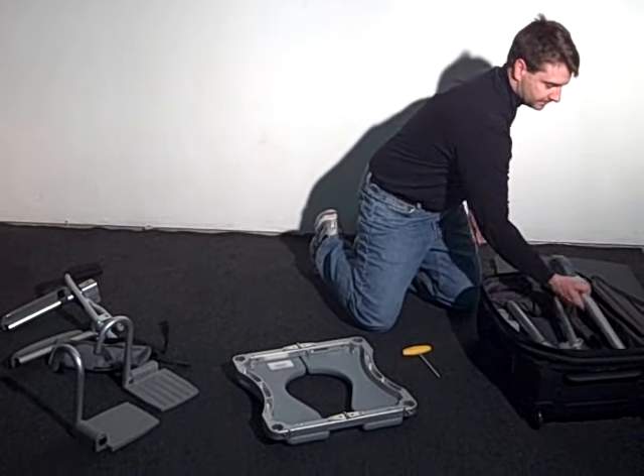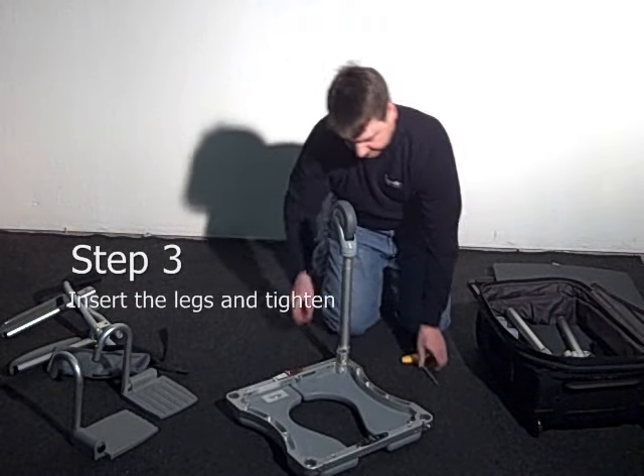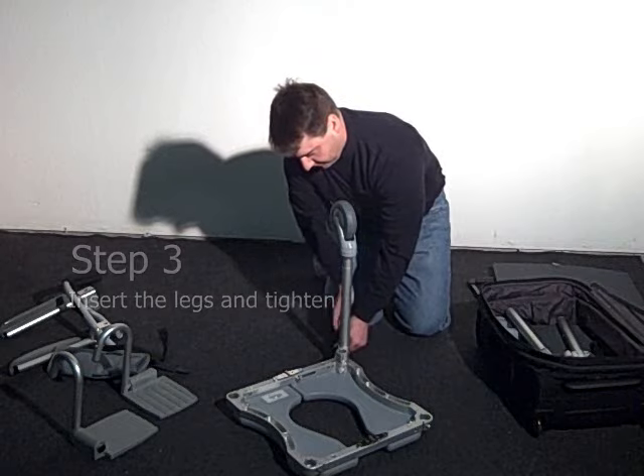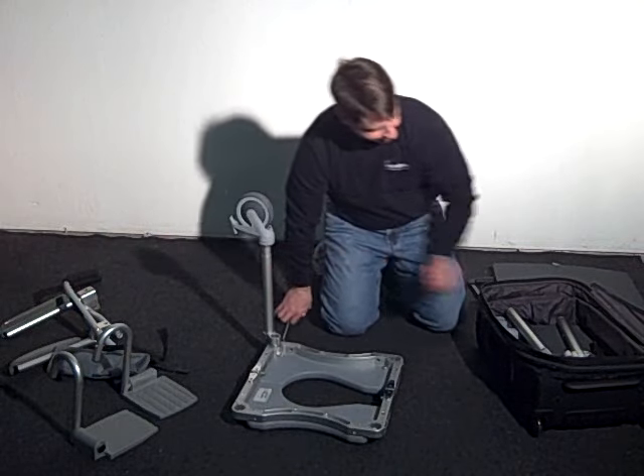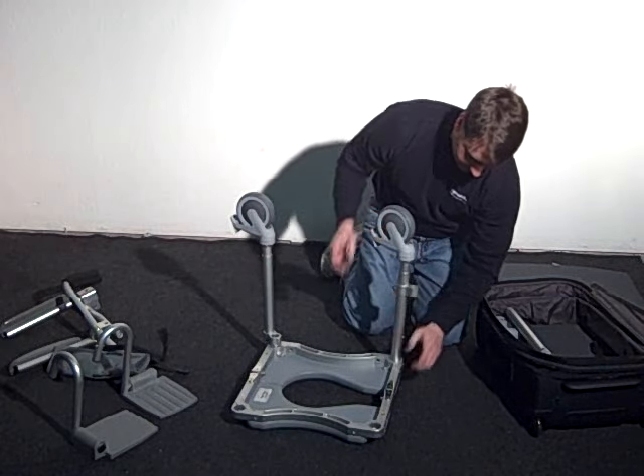Then you'll want to install the forelegs. Note the rear legs have an offset elbow. Position these legs at a 45 degree angle relative to the frame and make the small pins of the offset pieces into the corresponding holes in the frame.